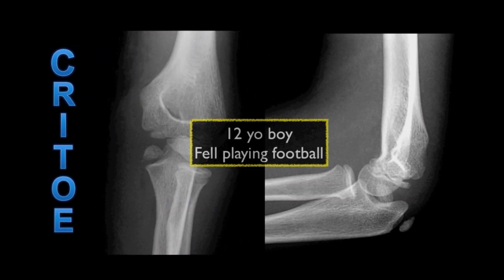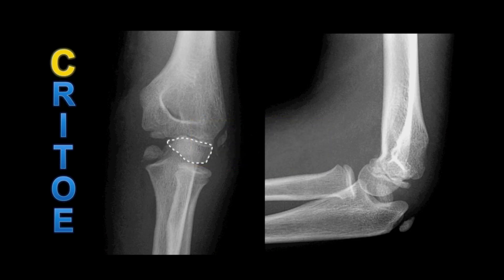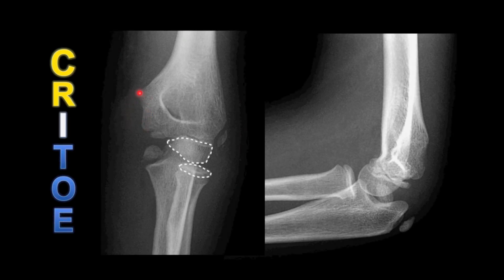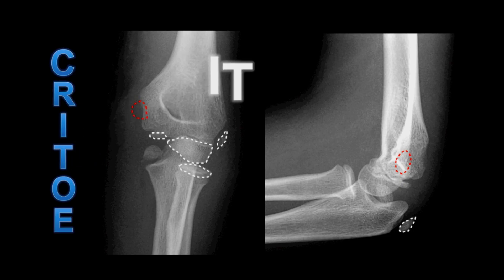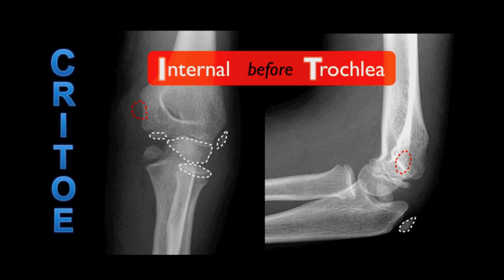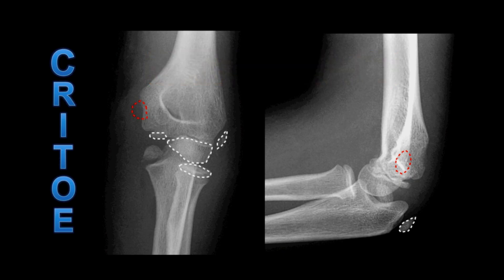Here is a 12-year-old boy who has fallen whilst playing football. We can see that he has a capitellum and a radial head in its normal position, but the internal epicondyle cannot be seen in its expected location, despite the fact that the trochlea, the olecranon, and the external epicondyle are all present. The extra bone fragment here on the AP image and here on the lateral image represents the internal epicondyle, which has become avulsed and sits inferiorly within the joint. The internal epicondyle is the most common of the ossification centres to become fractured and avulsed. If you had to remember just one thing from this tutorial, this is it: internal before trochlea. If on an elbow radiograph in a child you can see a trochlear ossification centre, you should always be able to see an internal epicondyle ossification centre, and if you can't, you need to look very hard to find the avulsed bone.